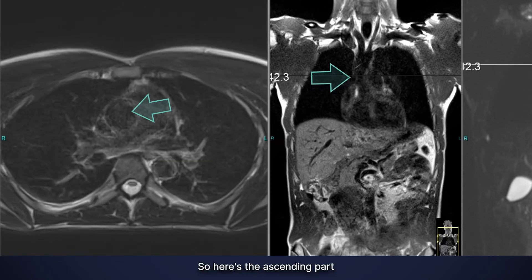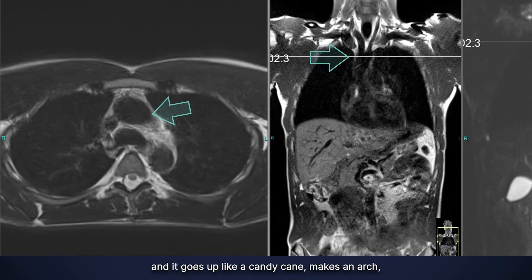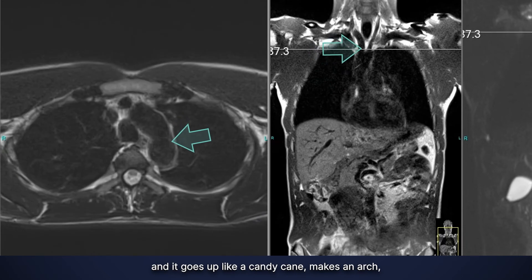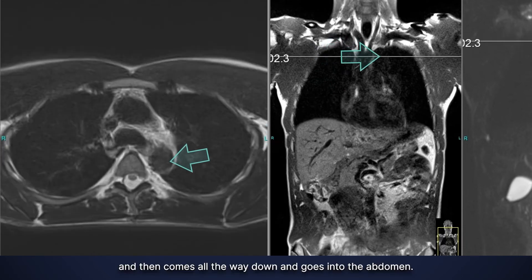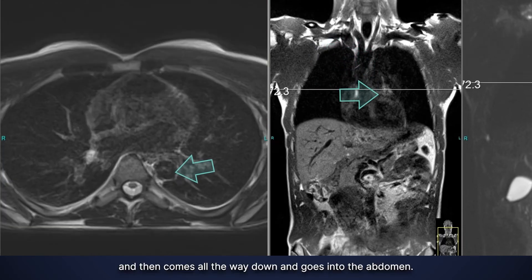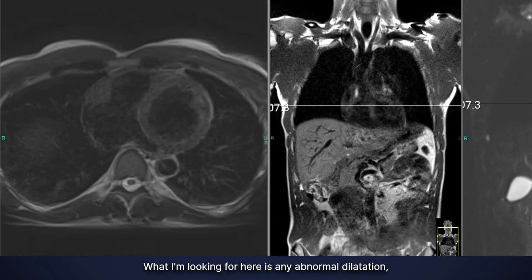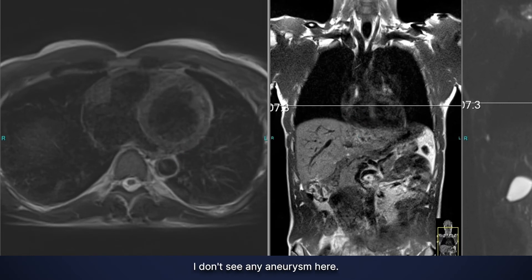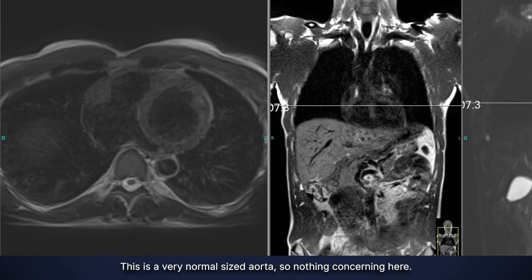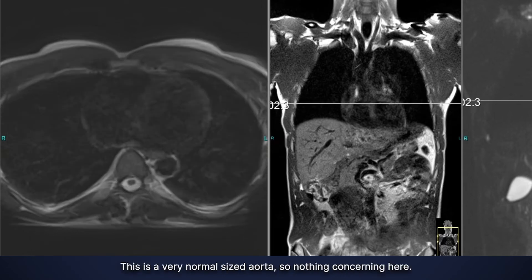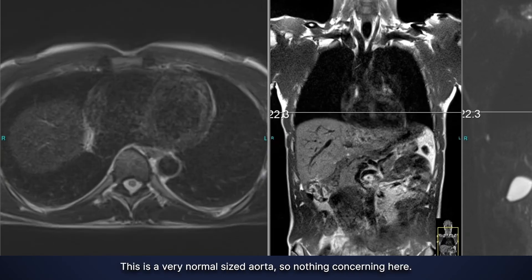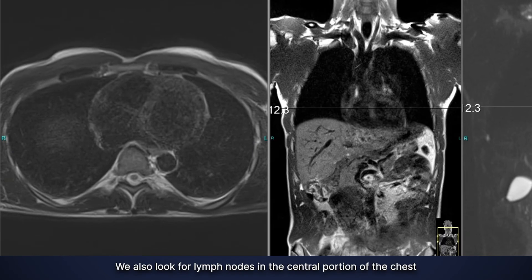Then I look at the aorta coming out of the heart. Here's the ascending part — it goes up like a candy cane, makes an arch, and then comes all the way down into the abdomen. What I'm looking for is any abnormal dilatation like an aortic aneurysm. I don't see any aneurysm here; this is a very normal sized aorta.